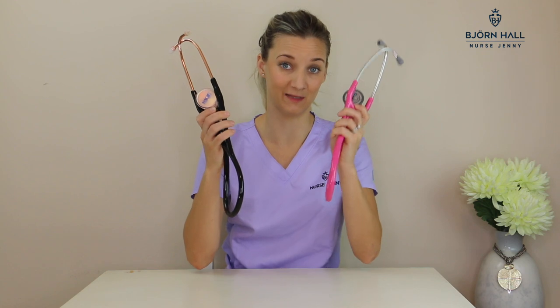Tubing feel: in my detailed review the MDF received 2.5 stars out of 5 and the Littmann received 3.5 stars out of 5. The main difference between the two is that the MDF's tubing is more rigid than the Littmann's.